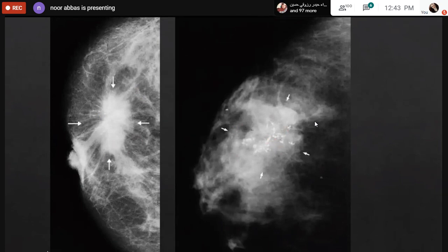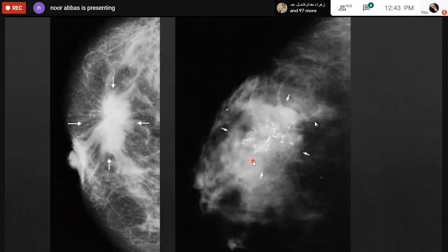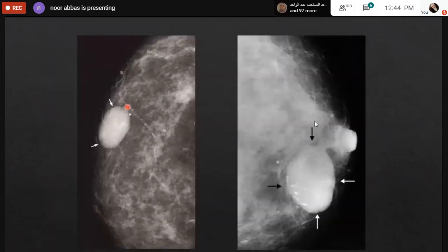هذه هي irregular, ill-defined calcifications, branching, linear, nodular, suggestive of malignant microcalcifications. Could be with a mass or in the absence of a mass, suggestive of malignant pattern. لكن البنايين masses on the other hand tend to be spherical, well defined. May also have calcifications، لكن calcifications مختلفة، تحسوها chunky and round and big، تسميها popcorn in the fibroadenoma of the breast. Here, regular circumscribed with coarse calcification, and this is also a circumscribed lesion that is benign.